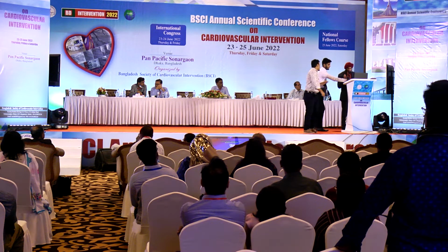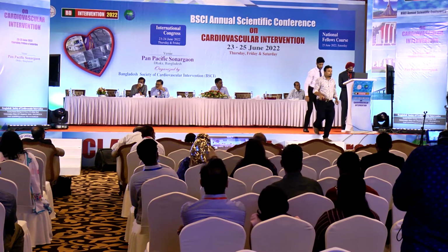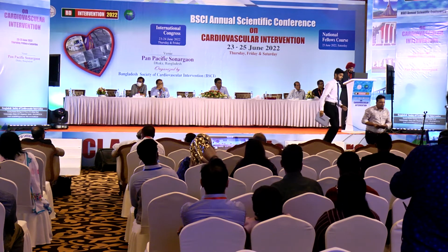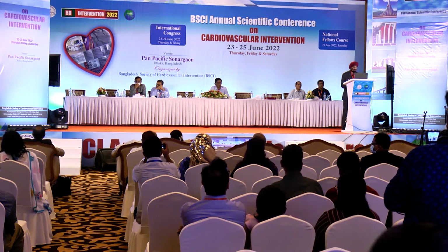Since the time given is too short, let me show you only the cases rather than having a detailed discussion on left main dissection management. Let us run through some of these slides.